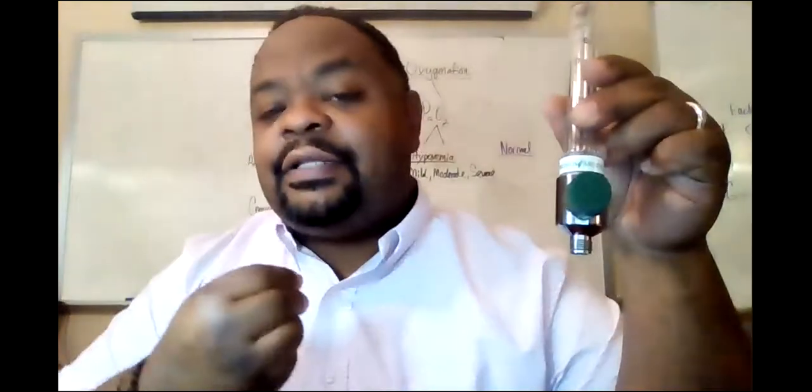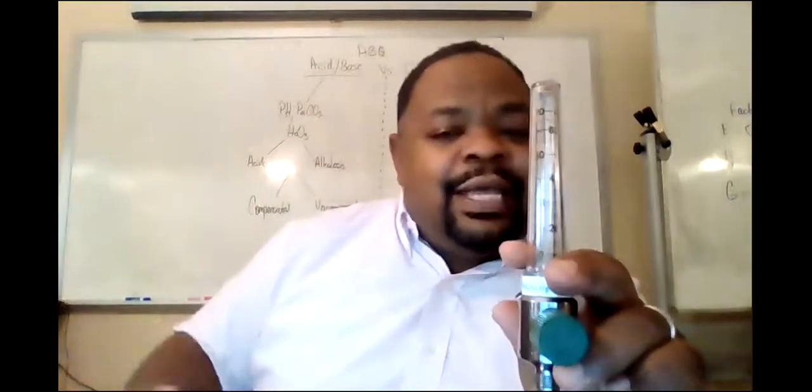Well, if I kink the nasal cannula and close it where it's no longer coming to me, that ball, if it is a compensated Thorpe tube, the ball will start to drop. They're saying it's accurate. It's telling, hey, he ain't getting no oxygen. I don't know what y'all doing, but the oxygen is not getting to him, all right? Because either the hospital wheel of the bed got rolled over my tubing, or I let the arm rest down and it pinched or occluded the oxygen tubing.